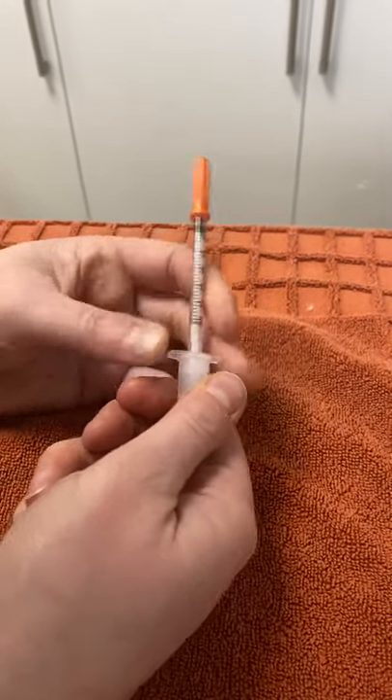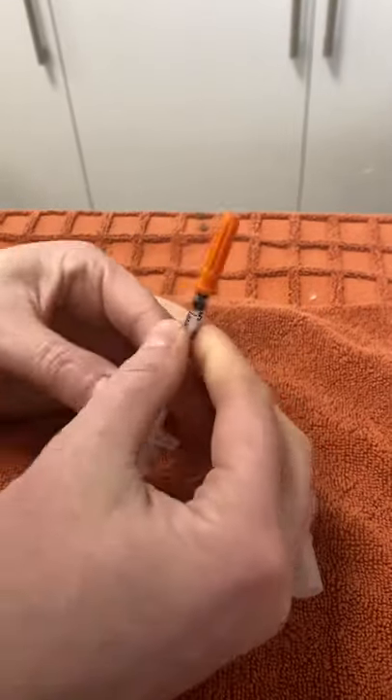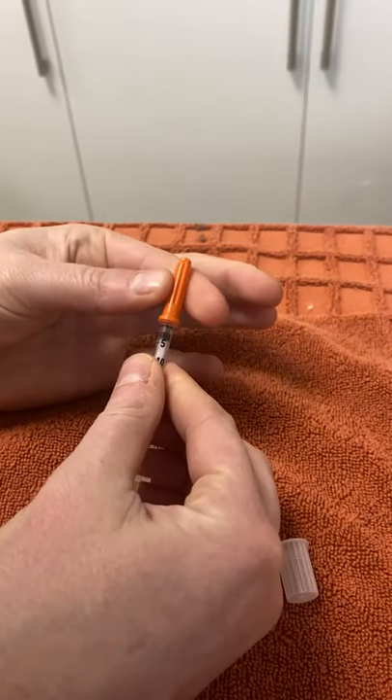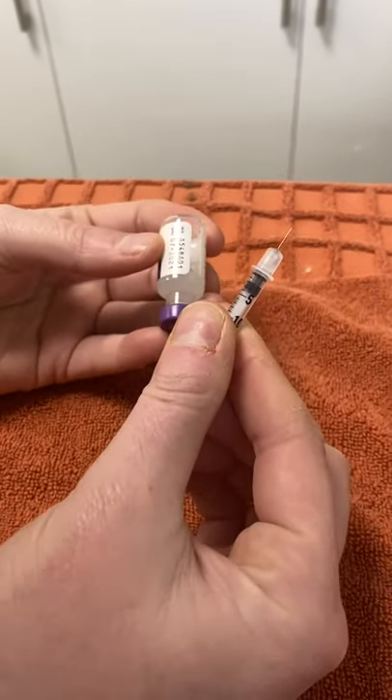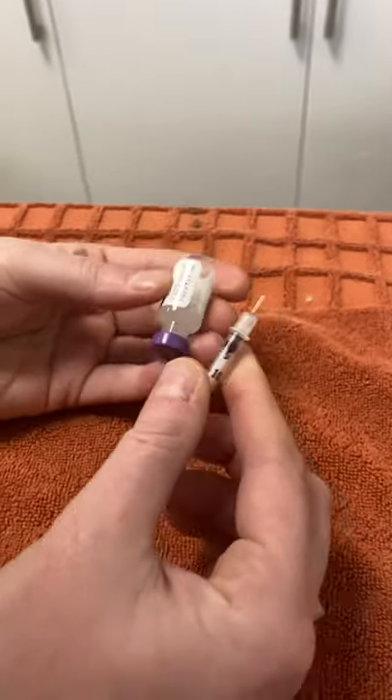They come with these little plastic things on the bottom — we want to take that off. We want to carefully take the plastic off that covers the needle underneath. Your insulin will be kept in the fridge in an upright position.